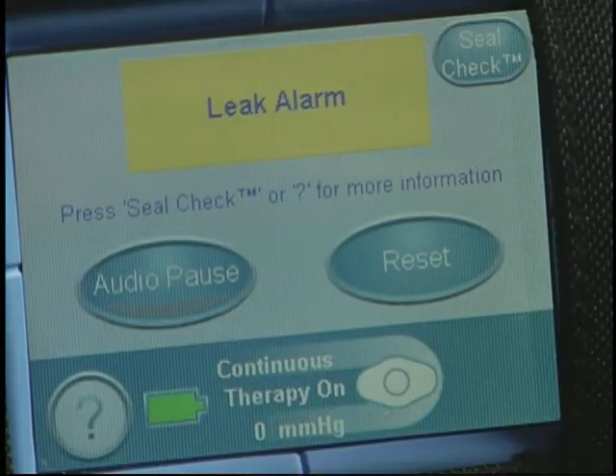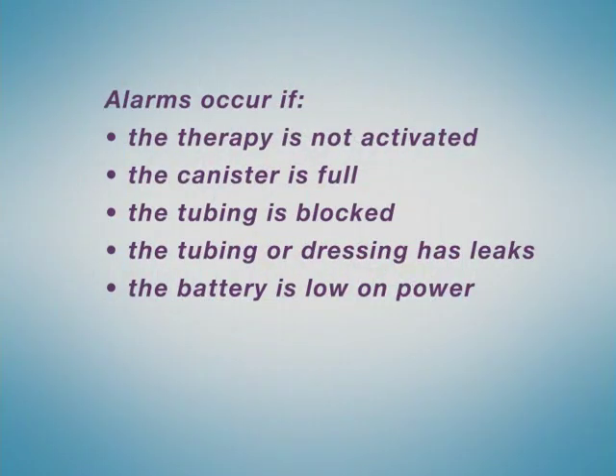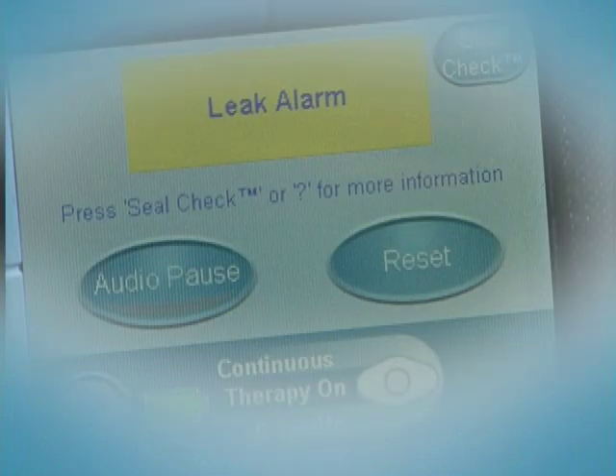The ACTIVAC therapy system is equipped with several safety alarms, which will sound and also appear on screen. Alarms occur if the therapy is not activated, if the canister is full, if the tubing is blocked, if the tubing or dressing has leaks, or if the battery is low on power. Refer to your device quick reference guide located in the pocket of your carrying case, or your user manual located in the hard shell delivery case, for instructions on dealing with a specific alarm. If necessary, call the 800-KCI toll-free number also found on the therapy unit for further assistance. An alarm should be attended to at once. Once the situation is corrected, therapy should be restarted immediately.